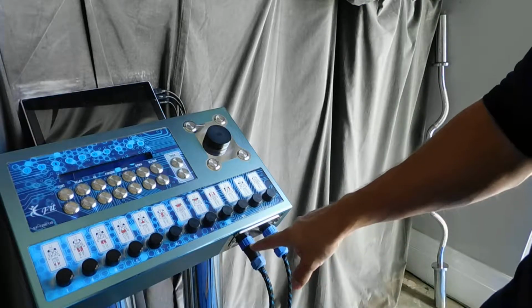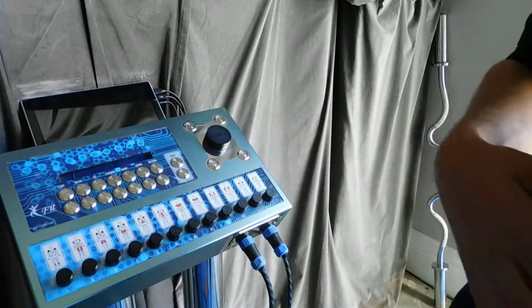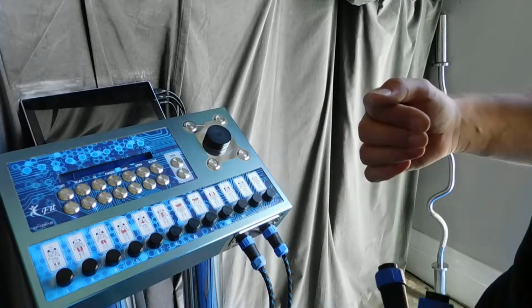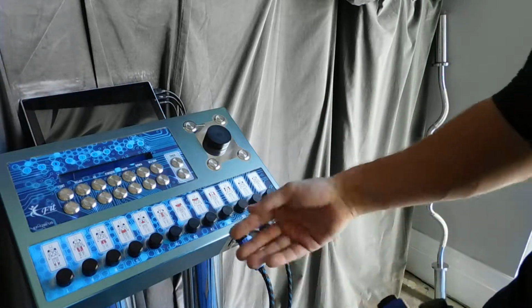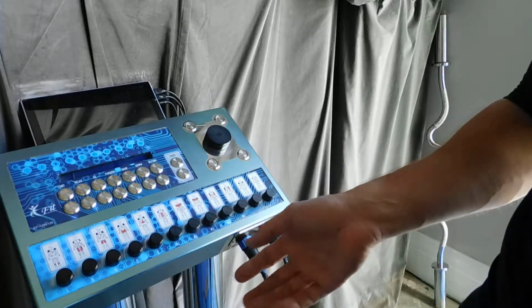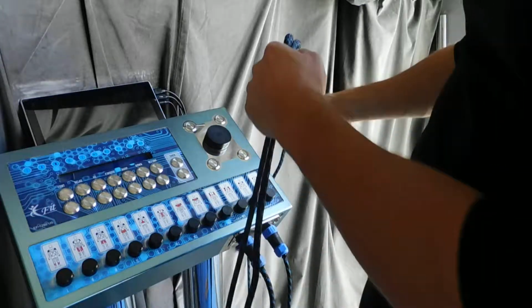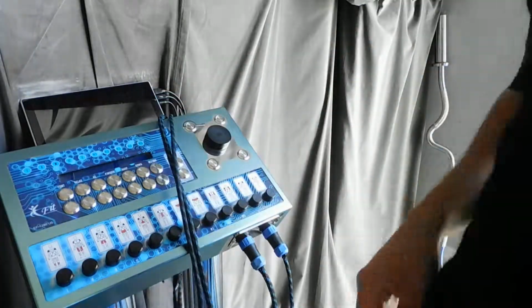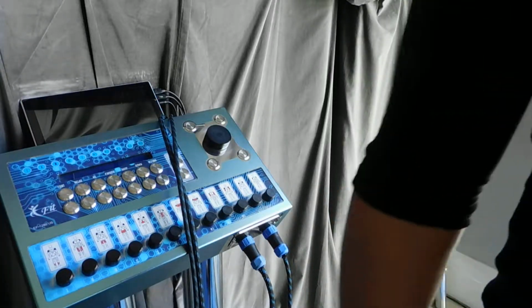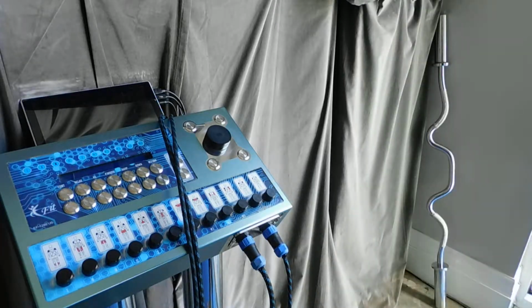So this goes into the jacket now, this goes into the pants now. So then if the jacket is now fixed and the abs are on because you switched these two cables, and the pants that you're wearing right now all of a sudden have something broken on them, then it's definitely the main cable, you need to replace it. But if you switch it and you still don't feel the abs, then it's definitely the jacket. So that's how you know, okay? And then if it's the jacket, we have to replace the main cable of the jacket. There is nothing else we can do if you have already gone through all the problems with the abs. So first try to fix the abs, obviously, and then go into the details.